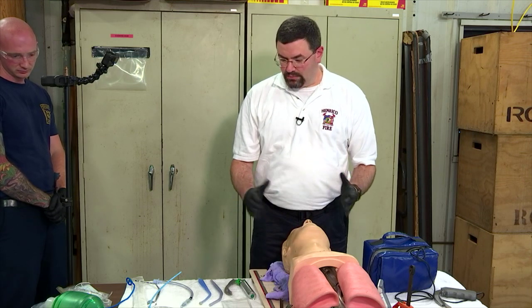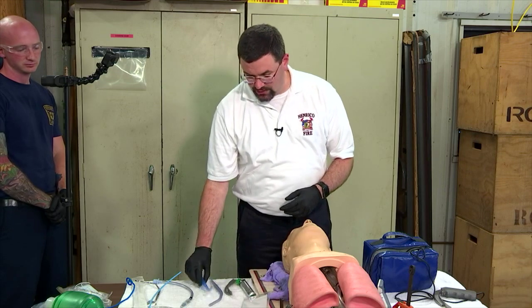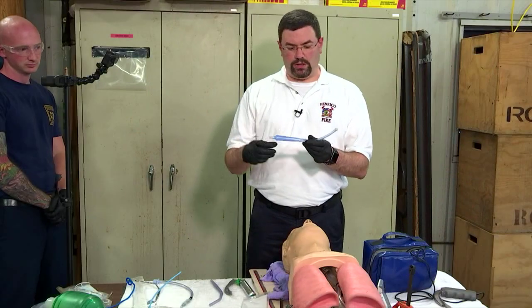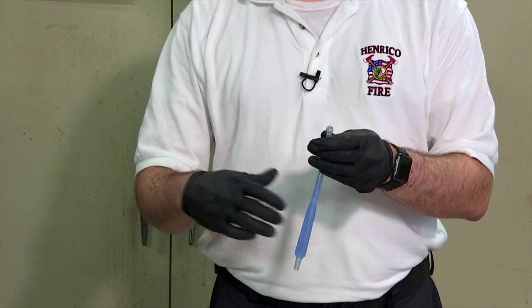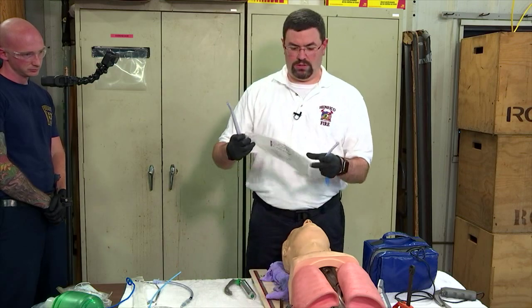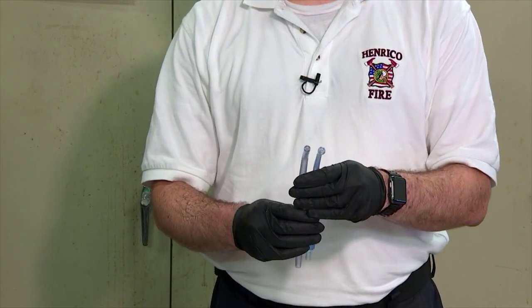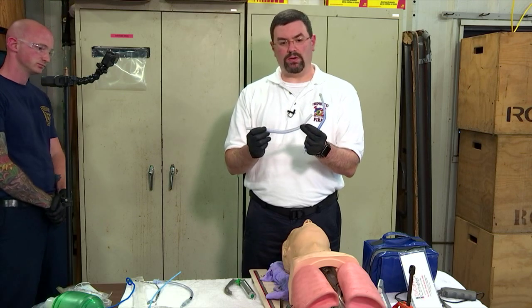So we've got our model set up here. I want to talk to you a little bit about the new suction catheters. You guys are used to the Yankauer suction catheter. The outside of this has been reinforced, and it's a very large device, but the real operating part is the internal diameter, not necessarily the outer diameter. So Dr. DuCanto has come up with this, basically taking the entire outside and making it all internal diameter, so you get a lot more suction, more bang for your buck.